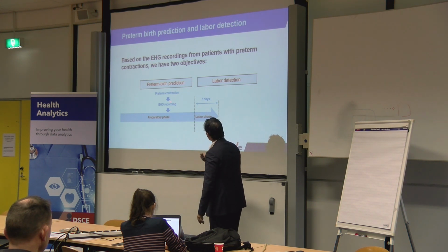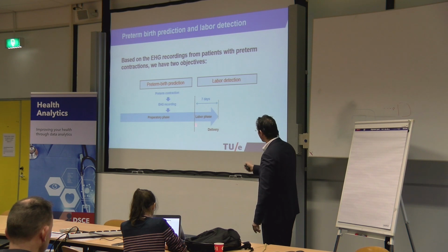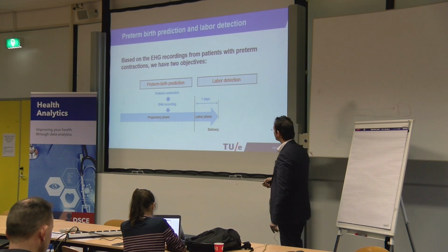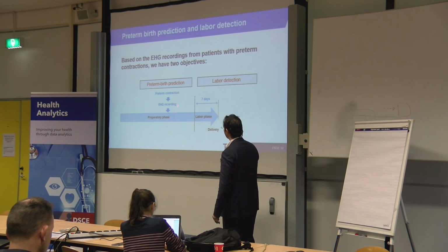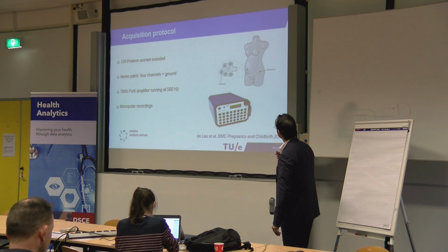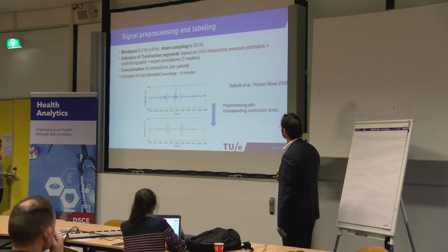What we consider preterm birth is before the 37th week, and the last 7 days we consider labor. These patients went to the hospital because of preterm contractions. We did the recordings with the same system, the NEMO patch. So this is the same protocol that I've shown you.